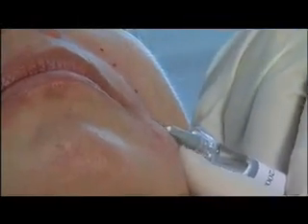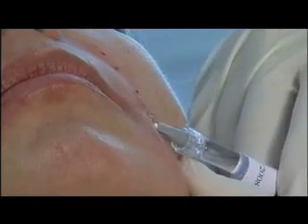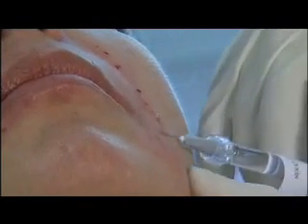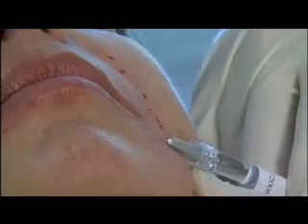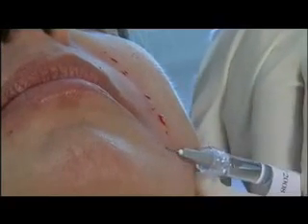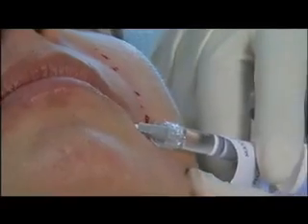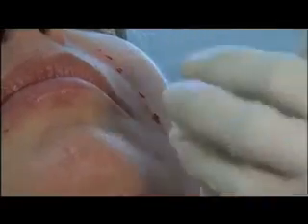When folds or wrinkles are too deep, the ladder technique is used. An injection that is perpendicular to the wrinkle or fold is performed to lift the ladder with hyaluronic acid.